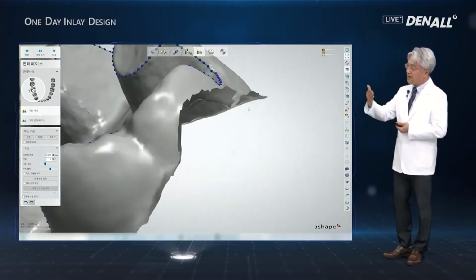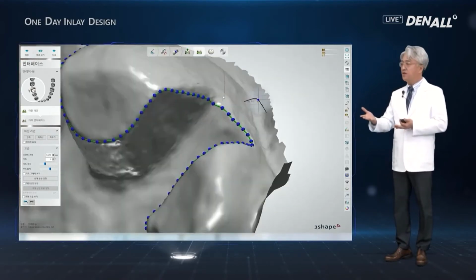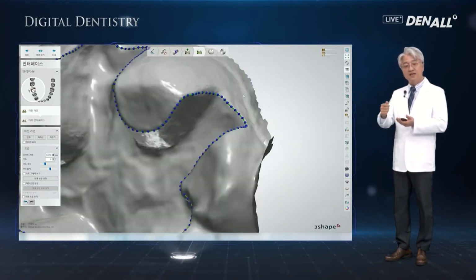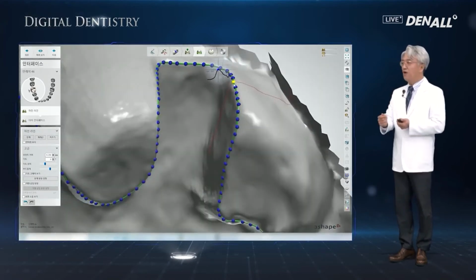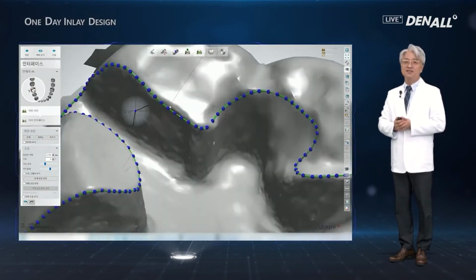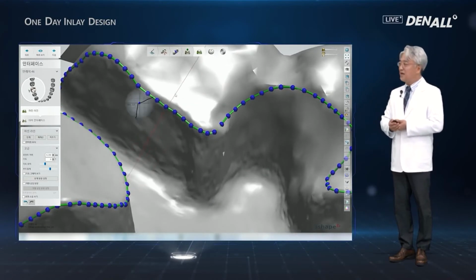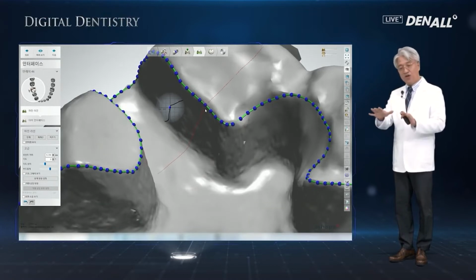Now, in doing precise prep, when we did the analog approach, if there was something that fell short, then lab technicians made the adjustment so that the final result of the inlay would have a good fit and be delivered to our clinic. But in the digital system, the disadvantage is that that's not possible. That consideration cannot be made because it's very precise, so it cannot really have room for compromise. So in doing preps or other steps, everything needs to be done very precisely.